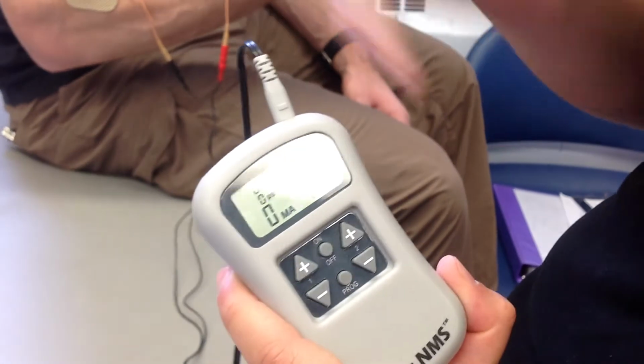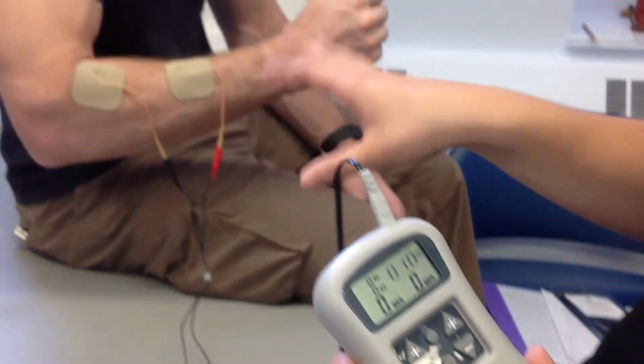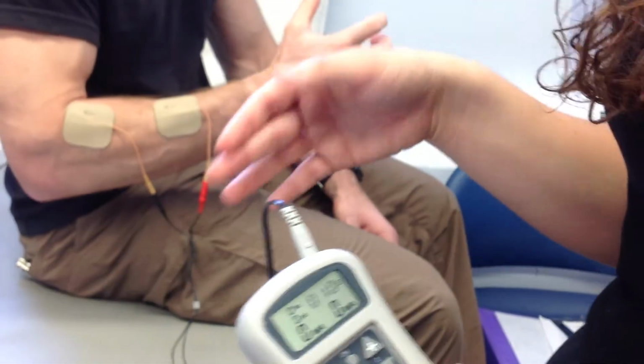Yeah, because it's on a 10 to 50 ratio, during the 10-second interval when it's on, that's when you would turn up the arrows. But when it's resting for 50 seconds, you do not.